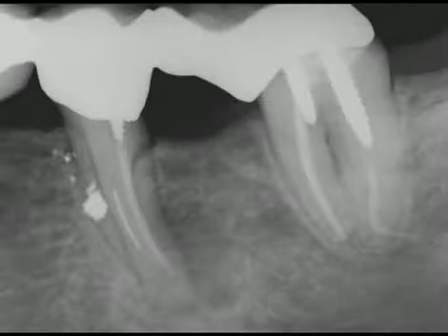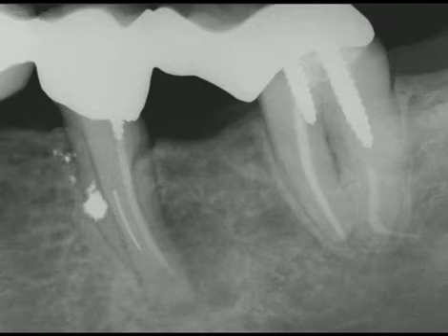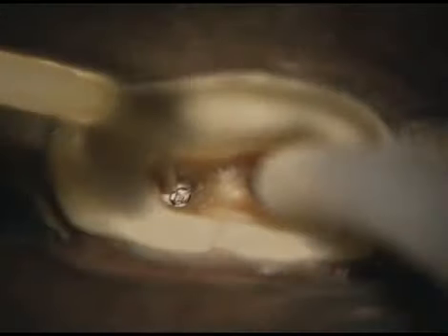Here's a preoperative radiograph of a hemisected molar, and the remaining mesial root is endodontically failing. Note a short screw post, a separated instrument, and amalgam debris from the previous surgical procedure. A clinical photograph shows the splint removed, the post out, and an ultrasonic instrument trephining around the broken file. A subsequent working film demonstrates 2 instruments negotiating the MB and ML systems and at length.